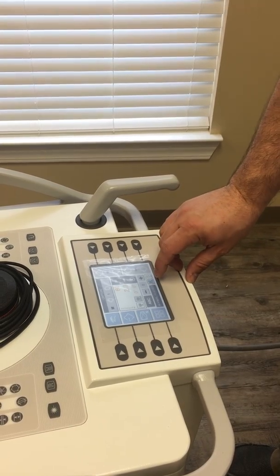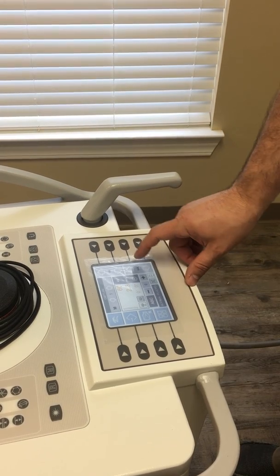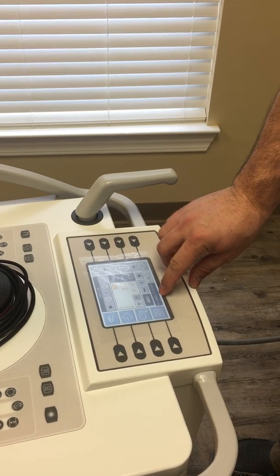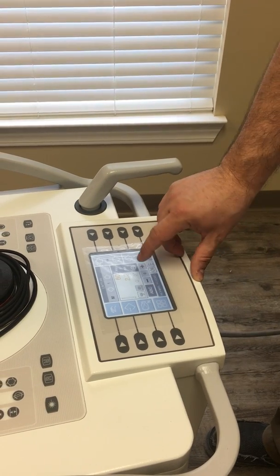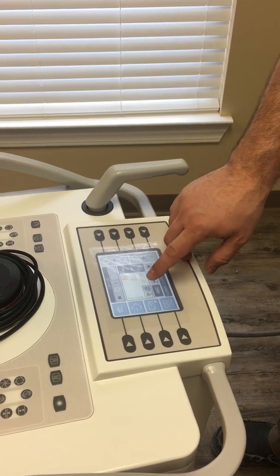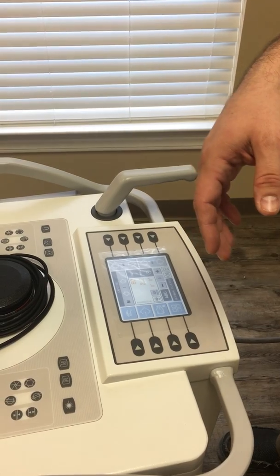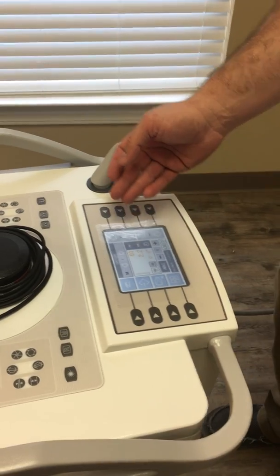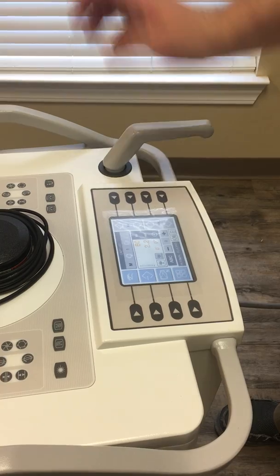This silences all the beeping and stuff that might be going on when you're adjusting things, although this seems to be pretty quiet. This is just telling you what mode you're in. You're in normal fluoro. This ABC function here is your auto brightness control, and all that's doing is making a slight adjustment, so it might give you a slightly brighter or slightly darker image. So if you don't want to make a manual adjustment in your technique and you notice that the image is a little dark, you might be able to just bump it up 1 or 2 and make an adjustment.